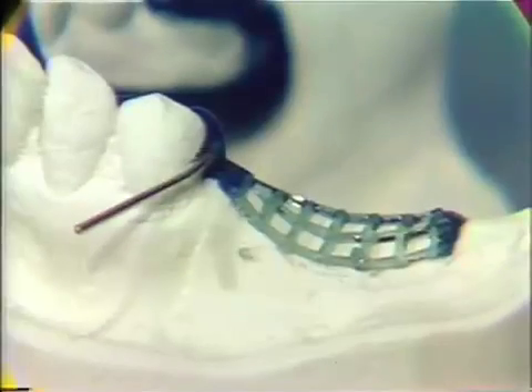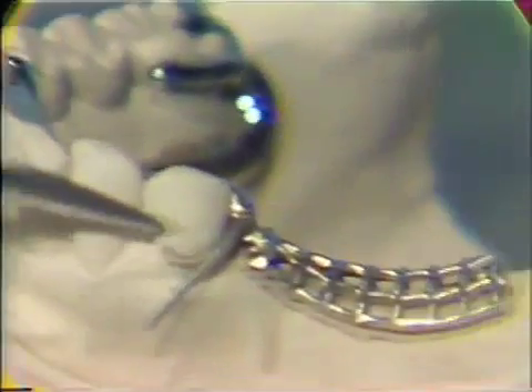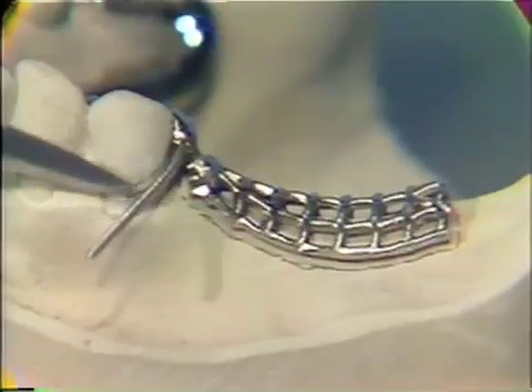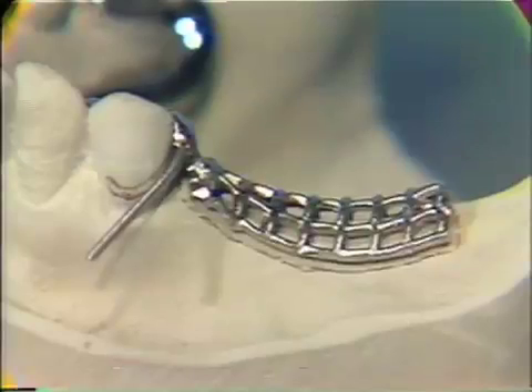After the framework casting has been fitted to the MasterCast perfectly, any combination clasps on the framework must be adapted to the abutment teeth to provide the correct amount of retention. As we have seen in the wax up stage and in the casting, the combination clasp was adapted approximately one quarter of the way around the abutment tooth. The final adaptation is done after we are sure that the framework fits the MasterCast.